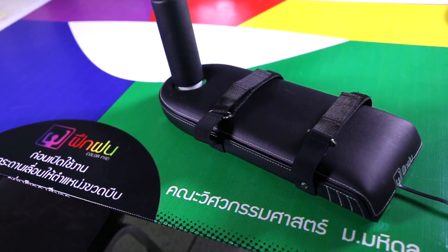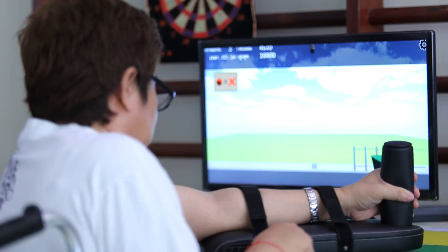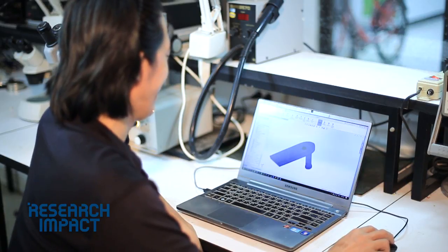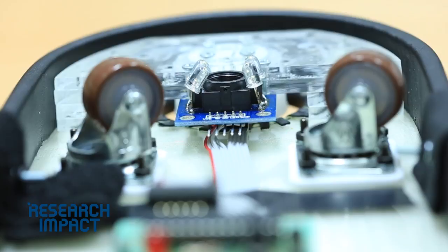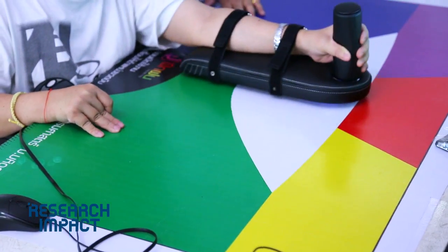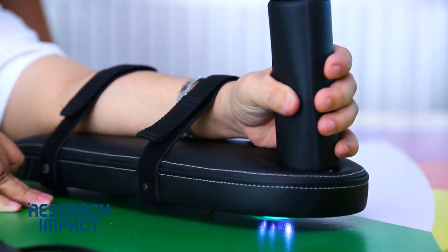The device is simple and can help stroke patients improve arm control. The main idea of FUGFON is to use hand movement to control game animation. We take a typical arm skateboard and then add electronics into it. We use a color sensor and a typical color pad. When patients move their arm around, the color sensor can detect the hand position, and that is used as a command to control the game.